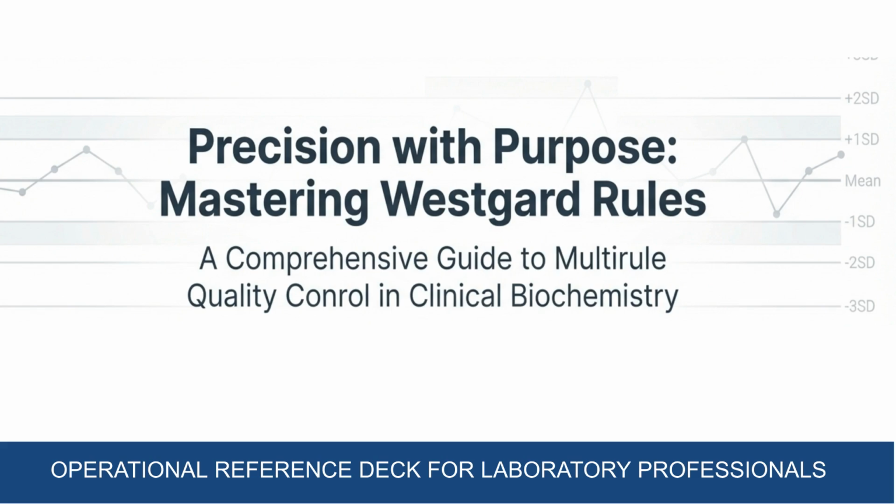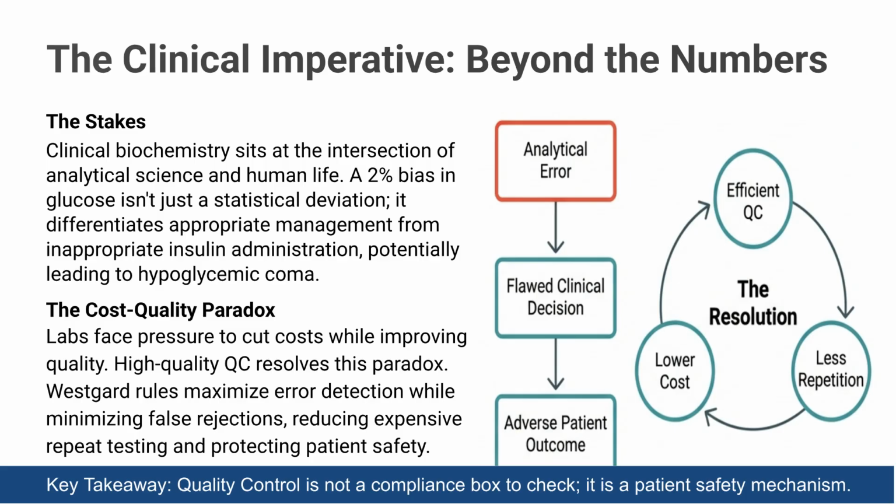Welcome to this essential guide on Westgard rules and quality control in the clinical laboratory. We will explore how these rules catch dangerous analytical errors while avoiding the trap of false rejections. Quality control is a patient safety mechanism, not just a compliance checkbox. High-quality QC resolves the cost-quality paradox by maximizing error detection and minimizing false rejections. This reduces expensive repeat testing and protects patient safety.